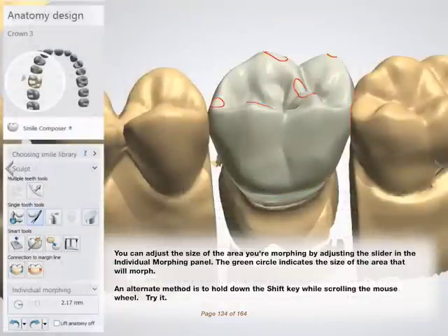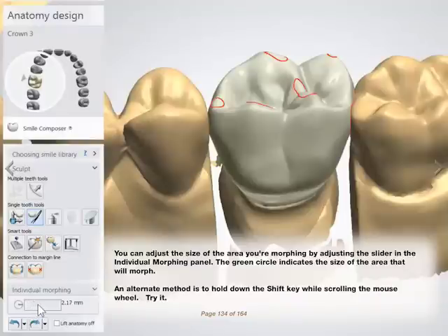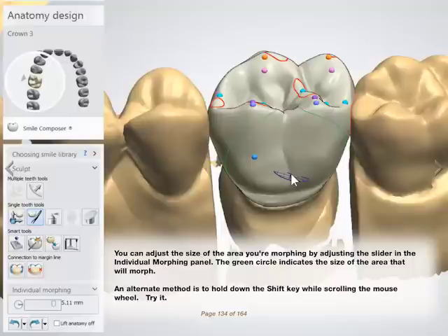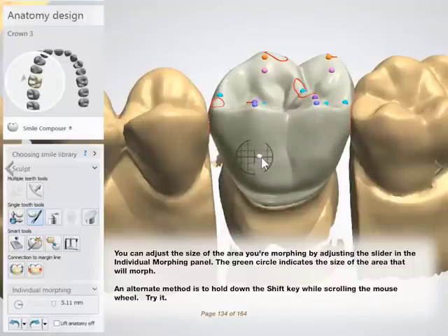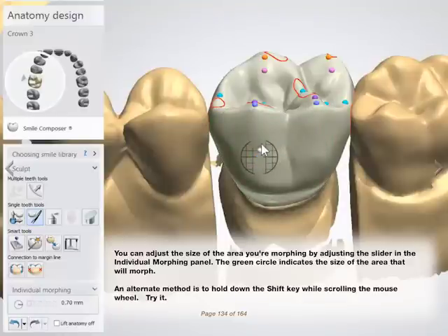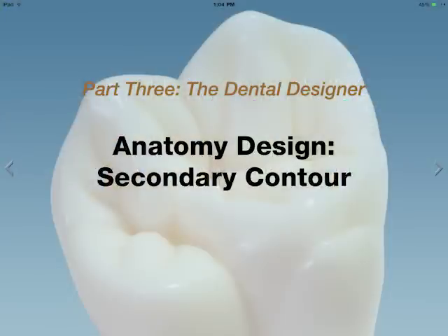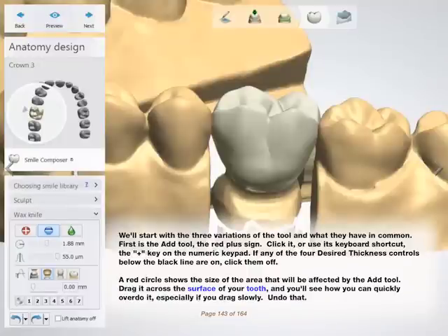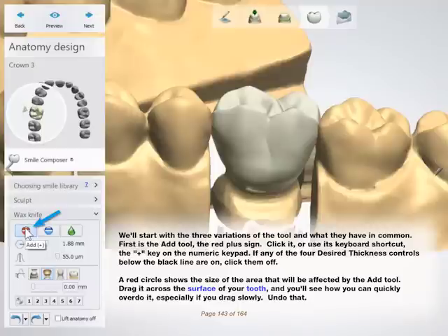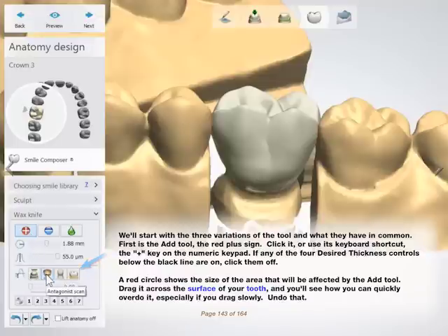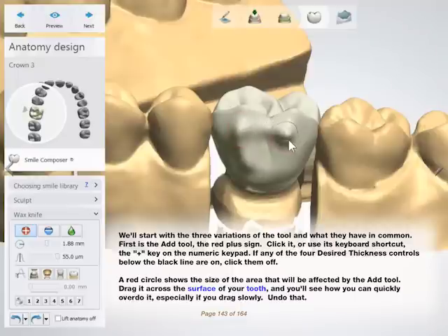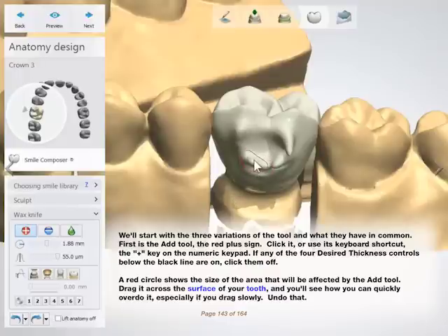You can adjust the size of the area you're morphing by adjusting the slider in the individual morphing panel. The green circle indicates the size of the area that will morph. An alternate method is to hold down the Shift key while scrolling the mouse wheel. We'll start with the three variations of the tool and what they have in common. First is the Add tool — the red plus sign. Click it or use its keyboard shortcut, the plus key on the numeric keypad. A red circle shows the size of the area that will be affected by the Add tool. Drag it across the surface of your tooth and you'll see how you can quickly overdo it, especially if you drag slowly. Undo that.